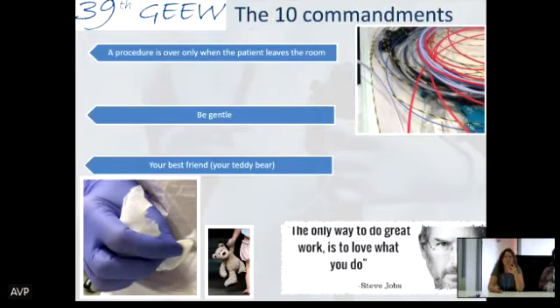And this is very important, to have the teddy bear, the gauze with water, which is important, putting water on all the devices to make it clean, and also to make it hydrophilic and to make the exchange easier.